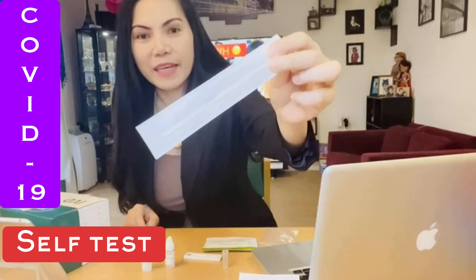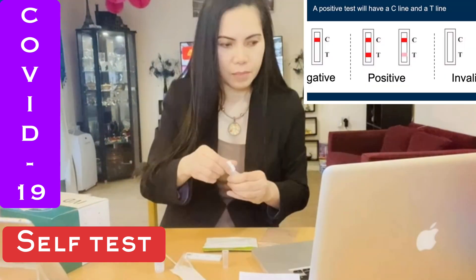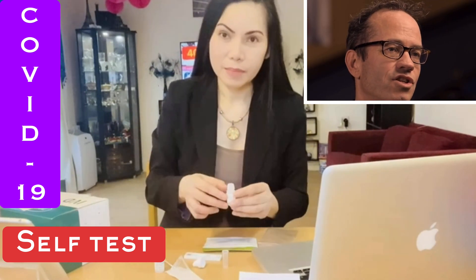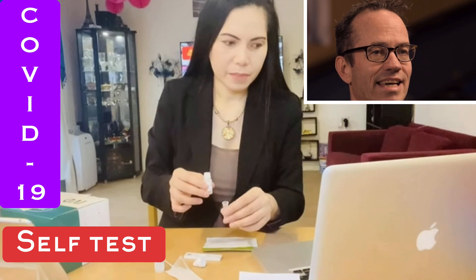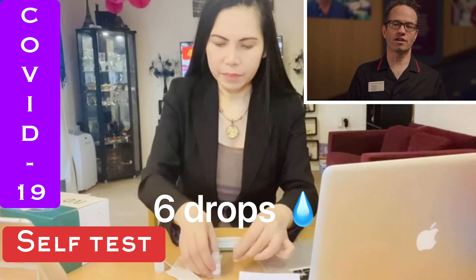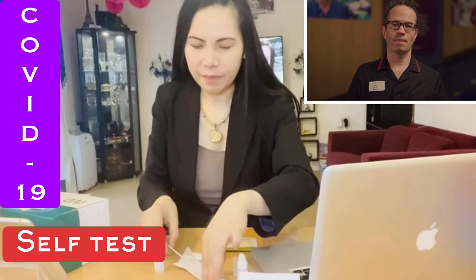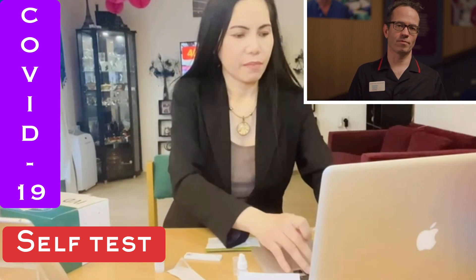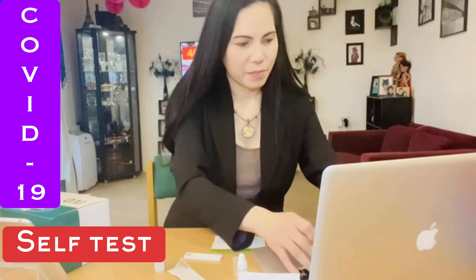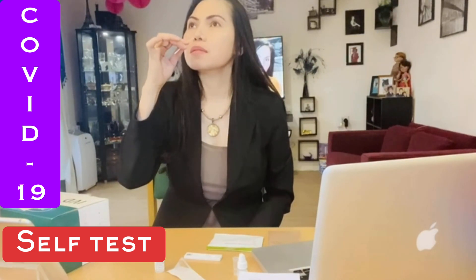This is the swab — it's quite small, just enough to cause slight discomfort. You insert it 1.5 centimetres, or around half an inch, into the nostril. You may feel slight resistance. Then you repeat the same in the other nostril. After that, swirl the small tip in the solution — swirl for around 10 seconds.